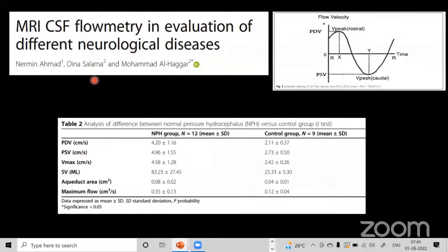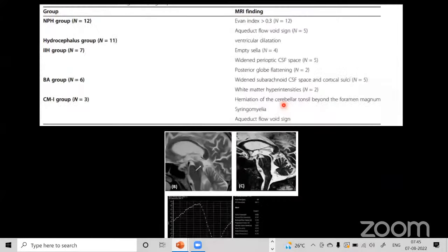Using phase contrast MR imaging, we can quantify CSF velocity, stroke volumes, and peak systolic and diastolic velocities. Doubling the control group value is considered a cutoff for shunt-responsive normal pressure hydrocephalus. CSF flow studies are important in normal pressure hydrocephalus, aqueductal stenosis, assessing ventriculostomy patency, intracranial hypertension with asymmetric age-inappropriate brain atrophy, and in Chiari malformations.